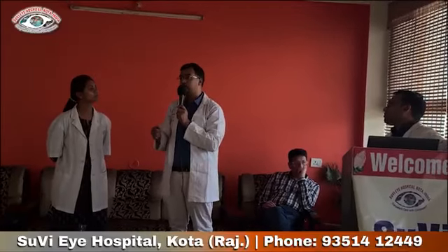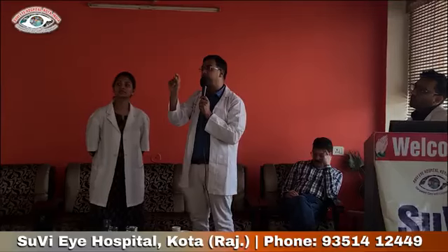Because sometimes there is confusion, like I had in my fellowship, where the cobblestone is there, so I stopped there. My mentor told me that no, you should go ahead of the cobblestone and then connect to the ora. That is the important point, because many times we see those degenerations where the laser marks won't take up the laser. So you should go ahead and then connect to the ora.